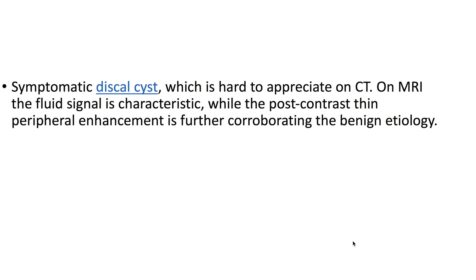This is a case of symptomatic discal cyst, which is hard to appreciate on CT. On MRI, the fluid signal is characteristic, while the post-contrast thin peripheral enhancement further corroborates the benign etiology.